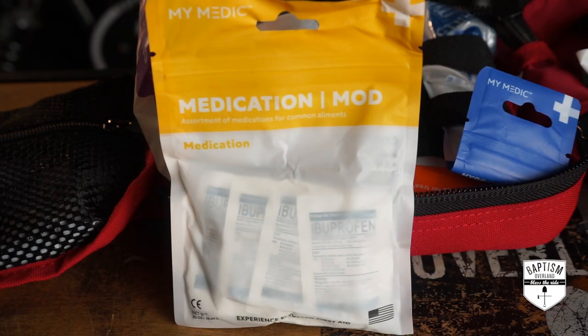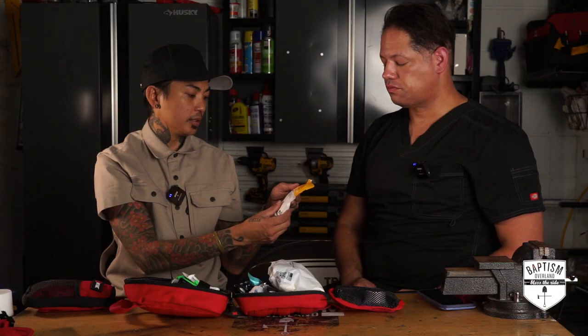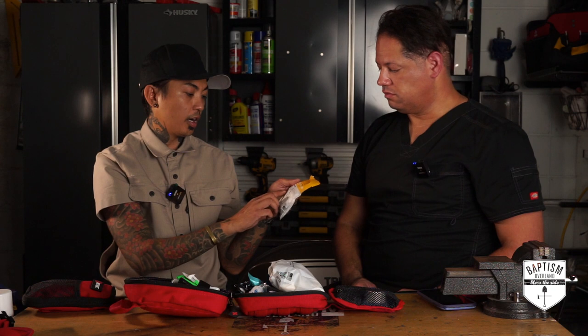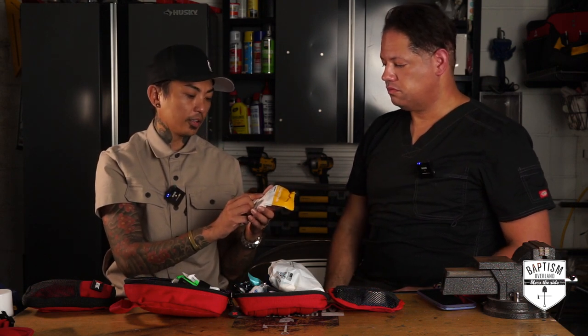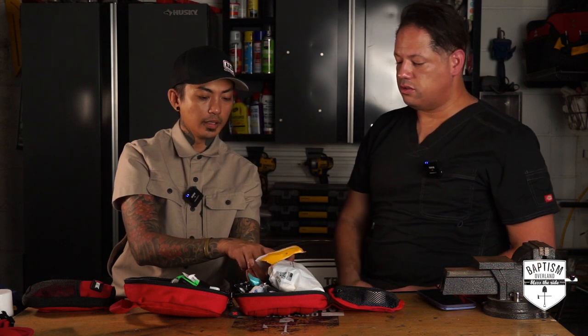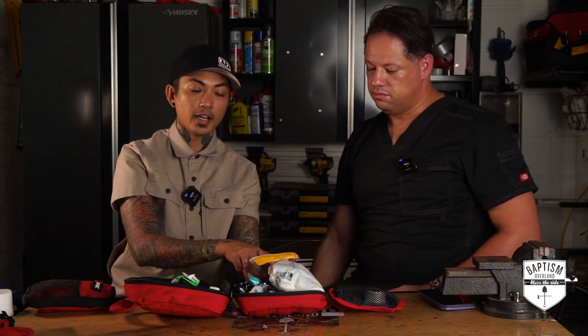Medication mods — in here you have ibuprofen, fever reducer, aspirin, Diotame for diarrhea and nausea, Dramamine for motion sickness. My wife brings Dramamine a lot when we go on boating trips. There's also Diphen — probably like a Benadryl or diphenhydramine — and Diamode, which is an anti-diarrheal.